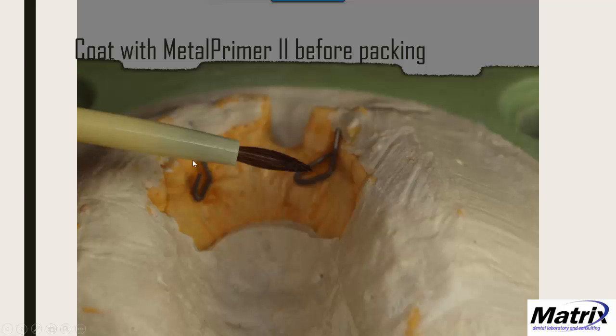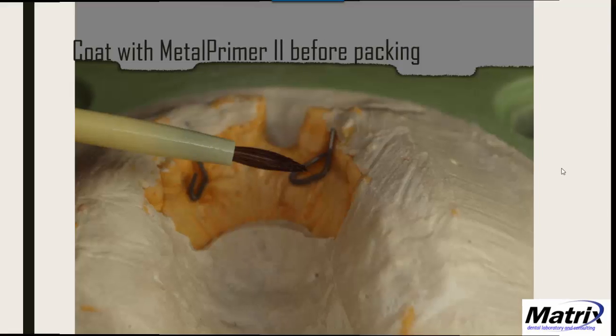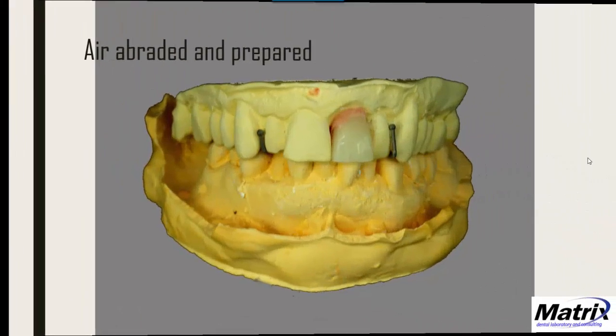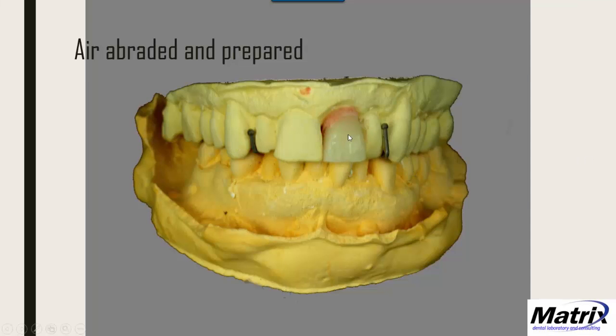Here's the case flasked up, and I'm adding Metal Primer 2 to the airabrated clasp tangs in place. Those air-dry for a minute, then I pack the case. I process for 48 minutes, break out and trim, fit it to the duplicate. Then I take it off and airabrade the ball clasp areas I'm going to opaque — just the facials, not over the top or anywhere that may flex.